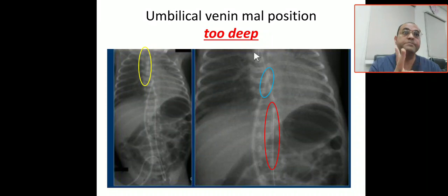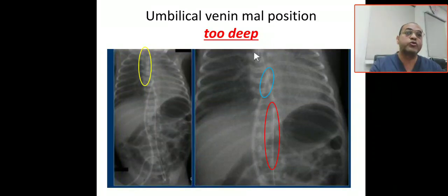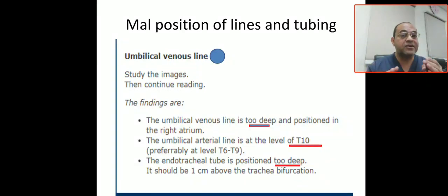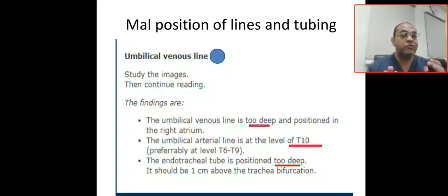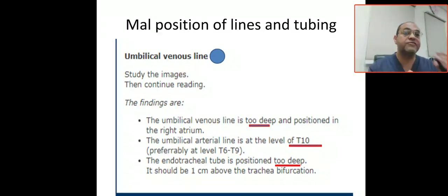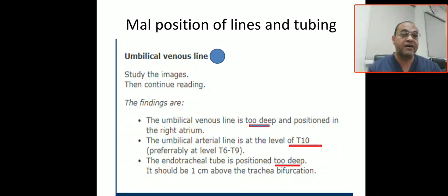To summarize: the umbilical venous catheter, the umbilical arterial catheter, and the endotracheal tube are all not in proper position. The umbilical venous catheter is too deep, positioned in the right atrium. The umbilical arterial line is at T10, and the preferable position is between T6 and T9. The endotracheal tube is also too deep and should be one centimeter above the carina.